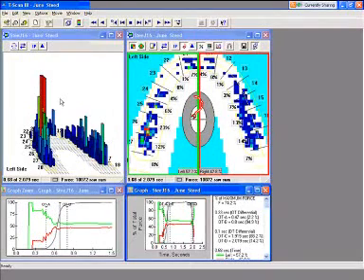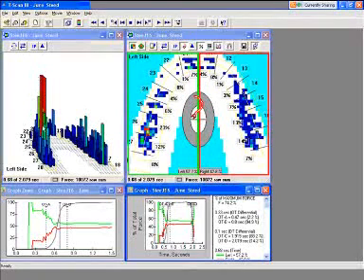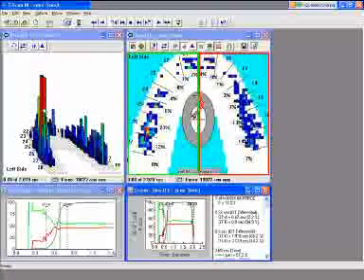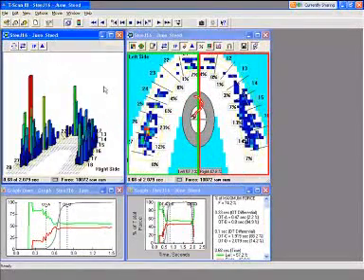Now, all of these numbers mean something. I don't want to get into that with you, but in a nutshell, if I'm in your chair and you see that perhaps I have some unexplained perio pockets in this area, or maybe I have a heavily restored tooth in that area, or I have a sensitive tooth in this area, or I have a slight recession starting here. Now, the patient might not understand slight recession or a 4-millimeter pocket that's not bleeding. They might not feel a need for anything there.